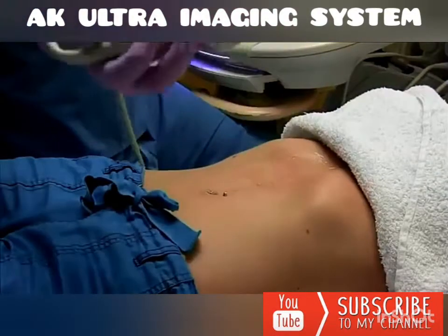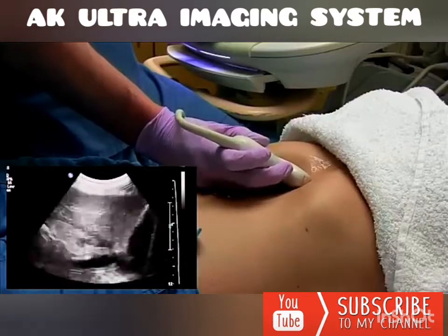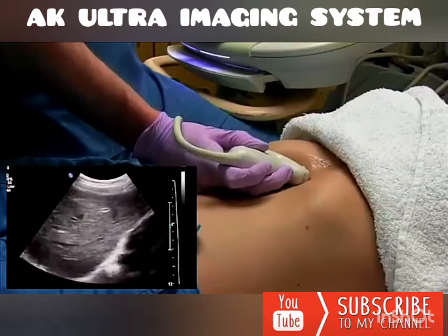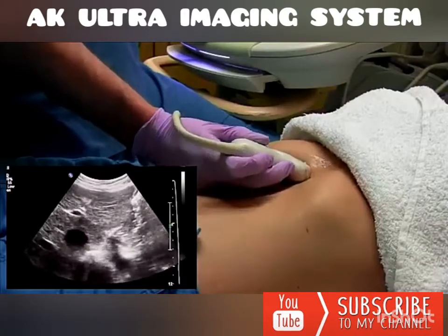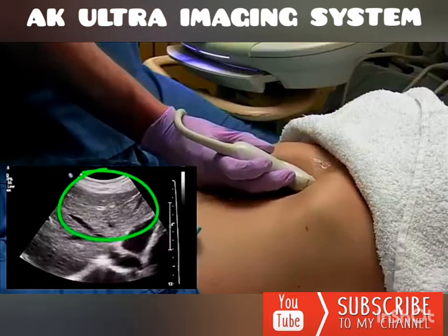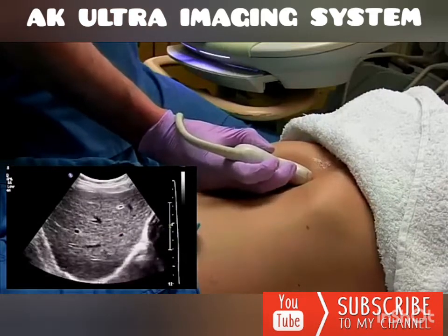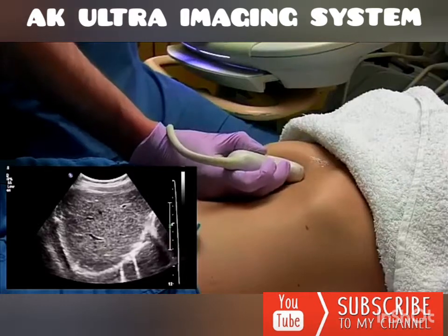You want to make sure you're sweeping through every organ, because if you don't sweep, you probably miss some anatomy and possibly some pathology too. So now from the left lobe, which is right here, you're going to angle slightly over and you should see the right lobe come into view.